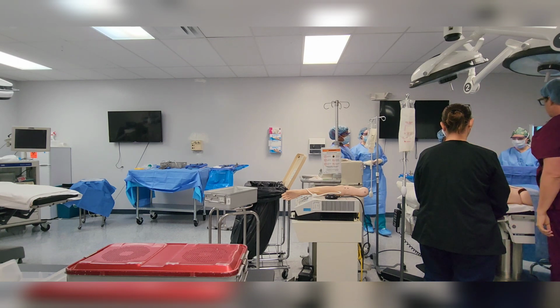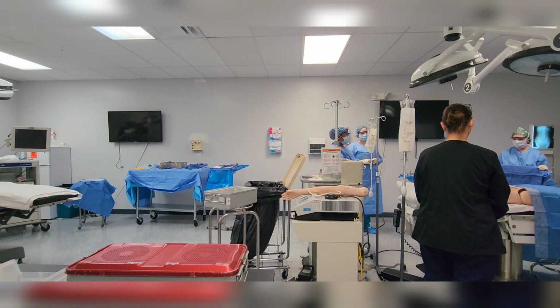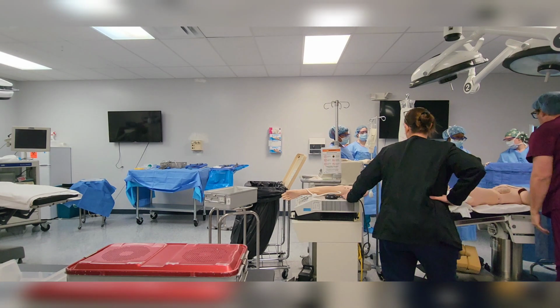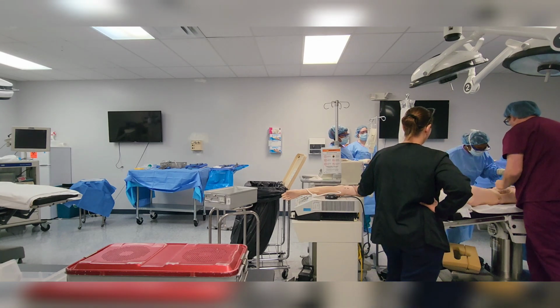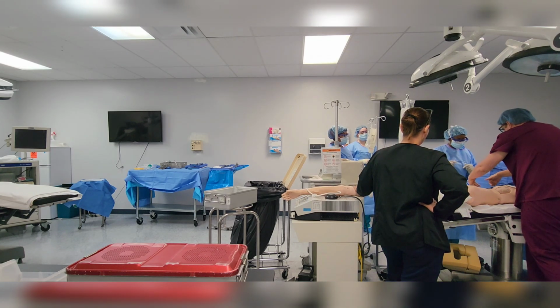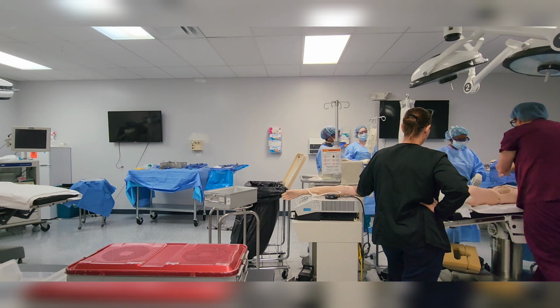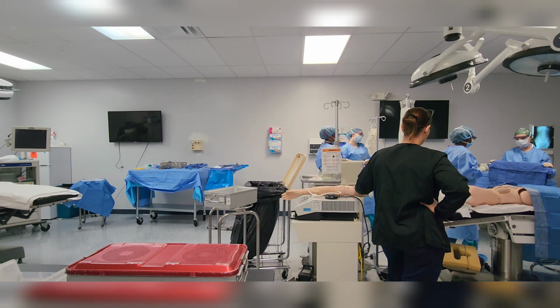Does that make sense? I'm going to let you think that through. Okay, that looks good. And just come in. Let's say that is the prep area. You want to come in here as close as you can, and just get in there now. Good. So here's the thing: you can't push it towards the field, but you can tuck it in a little bit like that, away. And you're fine. Then continue on.